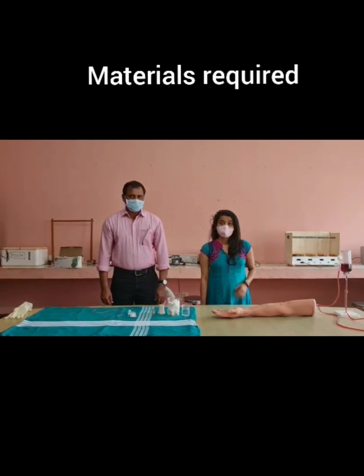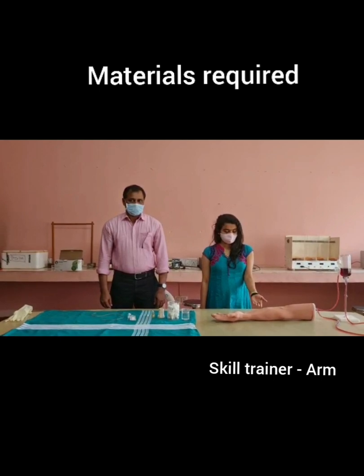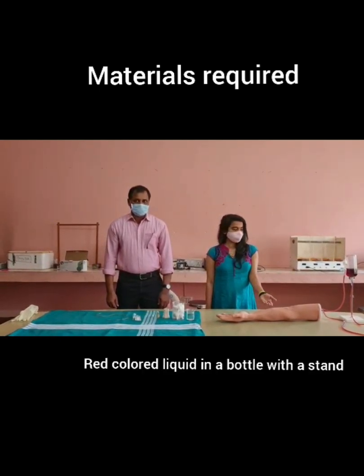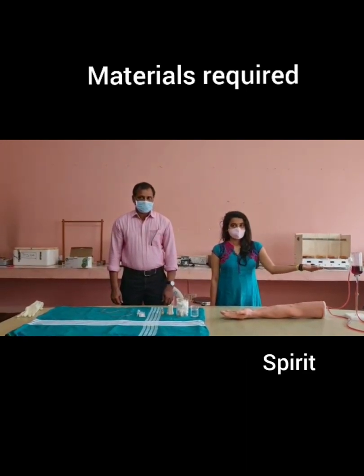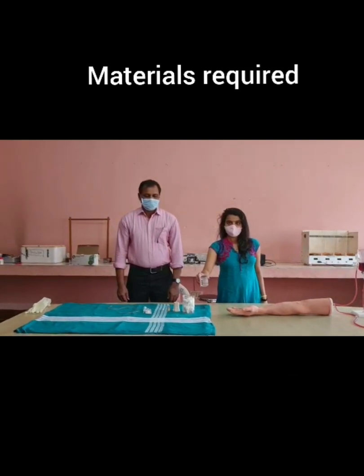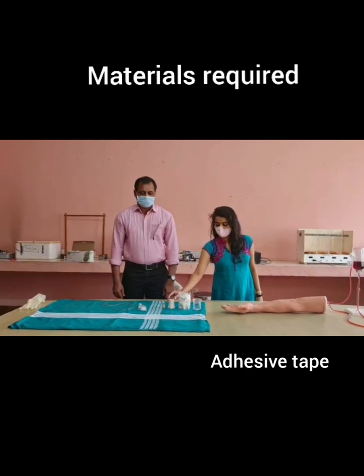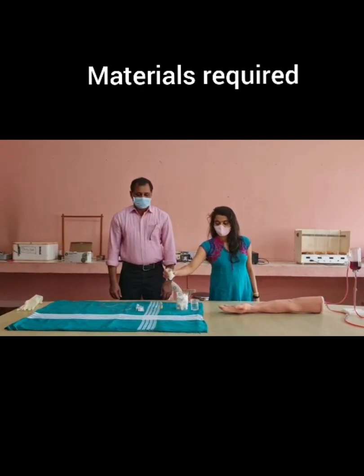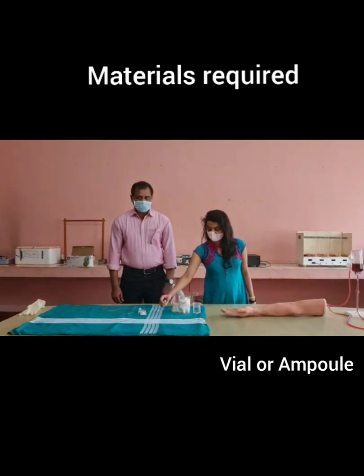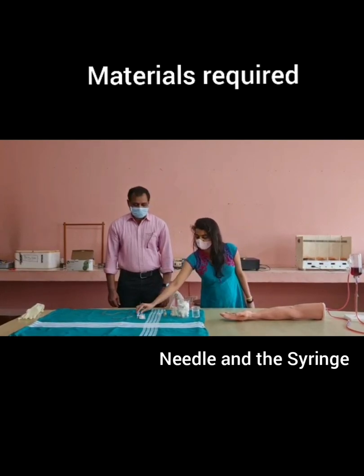Materials required: skill trainer or mannequin arm, red colored liquid in a bottle with stand, spirit, sterile cotton, adhesive tape, vial or ampule, needle and syringe.